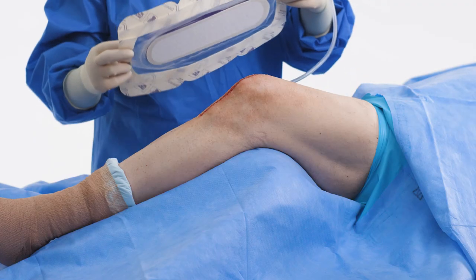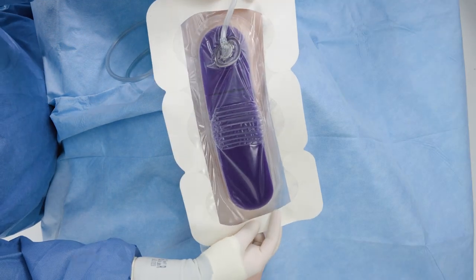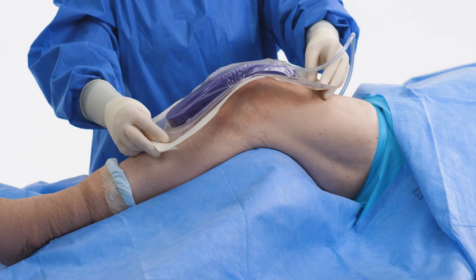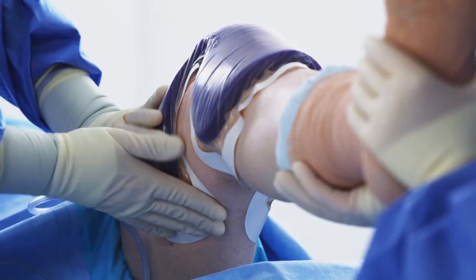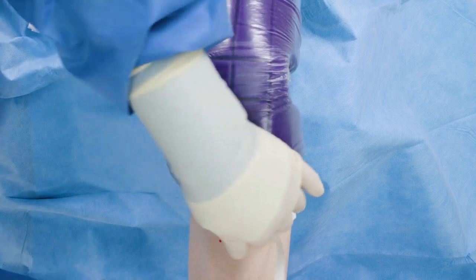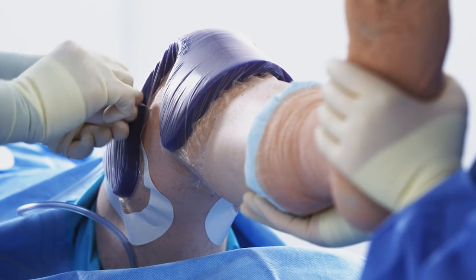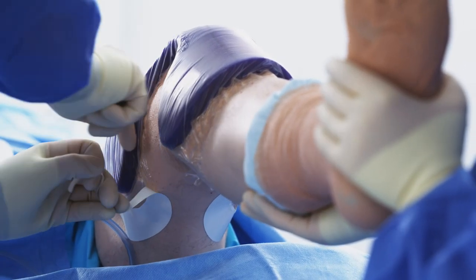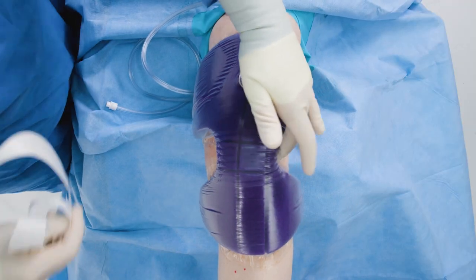When using the 3M Praveena peel and place dressing, center the cut foam over the incision taking care to avoid sharp bends or kinks in the tubing. No matter which 3M Praveena dressing you use, it's important to run your fingers around the edge of the dressing when applying and make sure to avoid stretching the material. Do not stretch the dressing or film during application as tension can cause skin damage such as tension blistering.